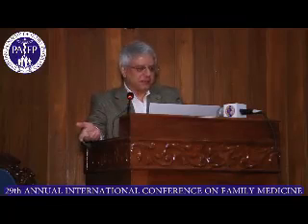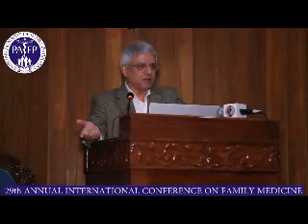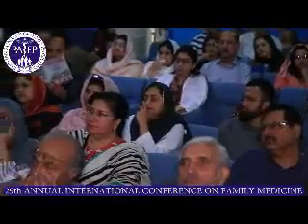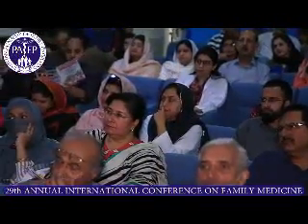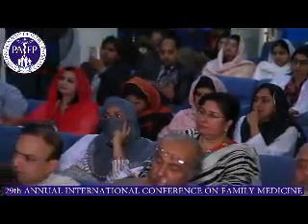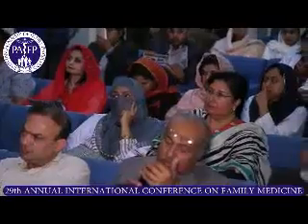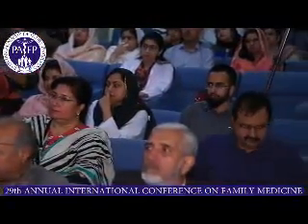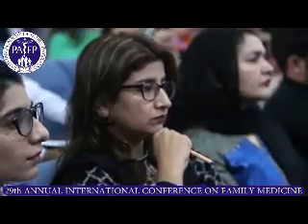And the assessment of these patients for stroke, I'm sure you will see or hear about it in different neurology talks later on. But the primary factor which you apply in stroke is basically to see if there is hemorrhage or not. The deficit or the presence of the stroke is a clinical judgment. It's nothing to do with the radiology. You know the stroke has happened. You know the brain attack has happened. But what to do next is much more relevant.